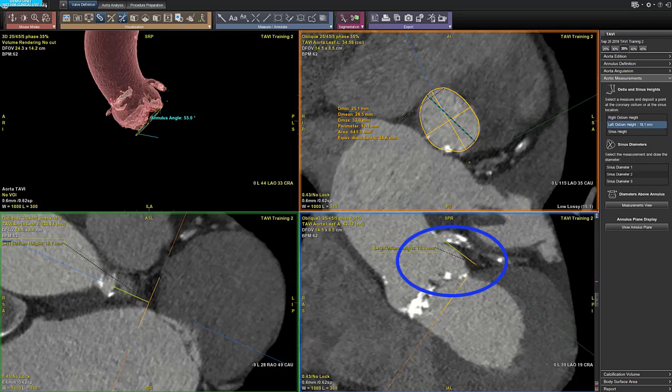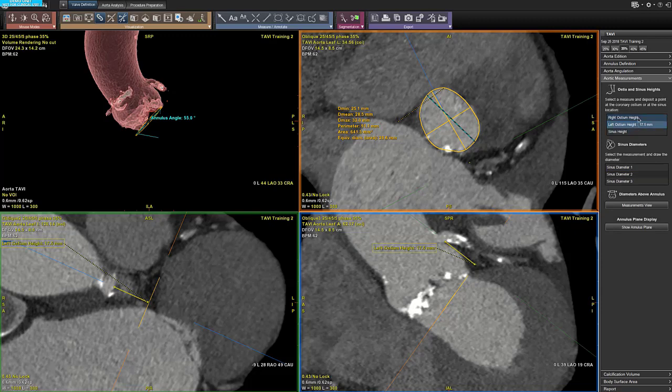To edit the measurement, you select it and edit it as a 2D distance. Now you do the same for the two other measurements, the right ostium and the sinus height.